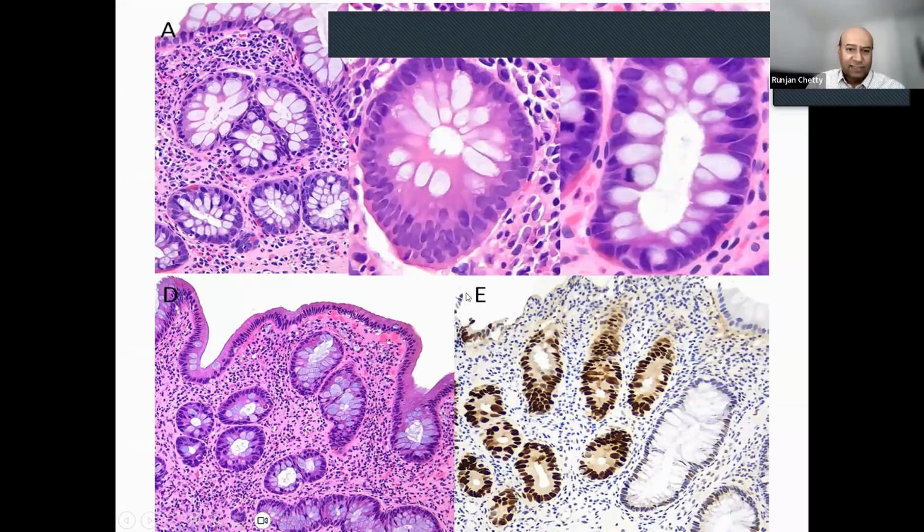And they're in isolation. It's a little tricky to extrapolate, really. But they can be minimally cytologically abnormal. Generally, you'll see that they cluster together. They have hyperchromatic, larger nuclei. And if they were in any other location, you would classify them as dysplastic. If you get high-grade dysplasia in basal glands, look for adenocarcinoma lurking nearby.